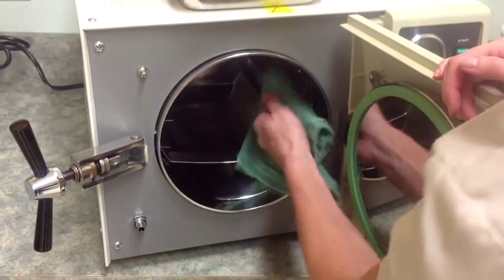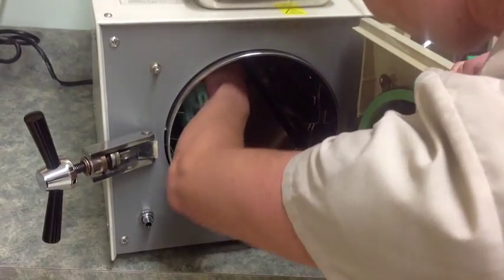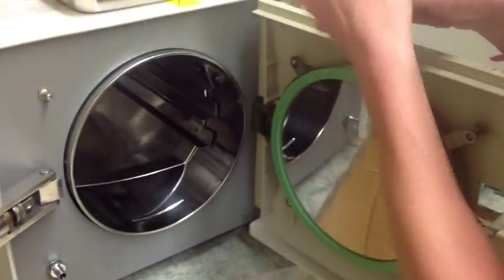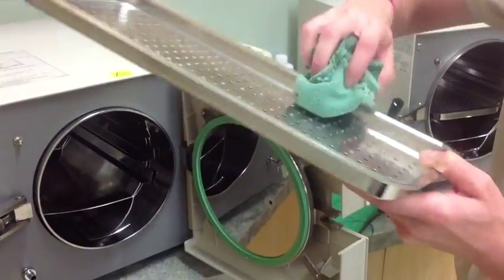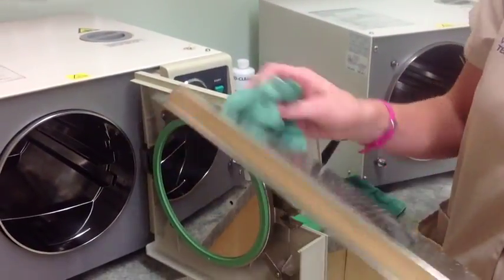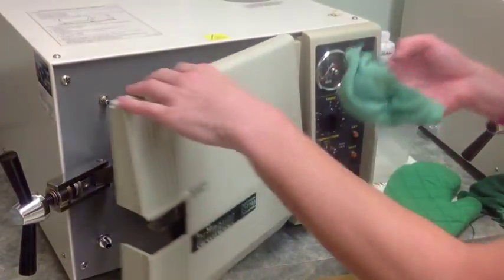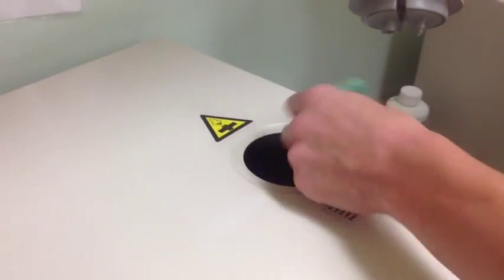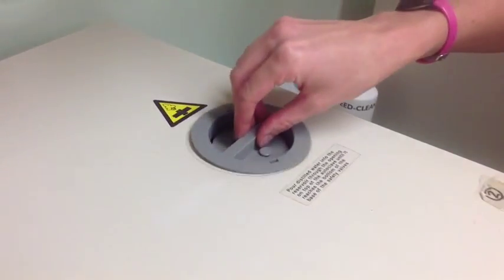Always handle the trays with protective gear in case the trays are still warm. Once the chamber is cool, you can wipe it down — the inside as well as the trays. Place the tray back inside the machine. Also wipe out the inside of the chamber and reservoir, being careful not to damage the heater element or the temperature and level sensors.